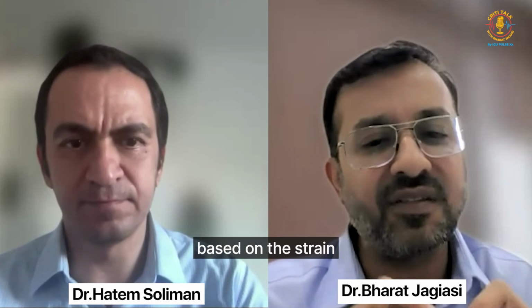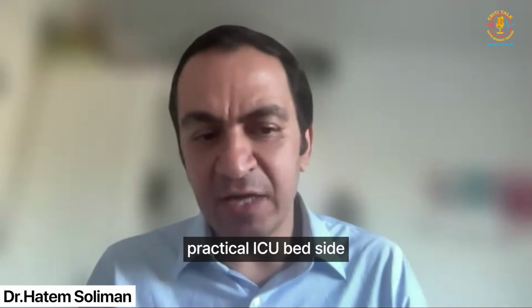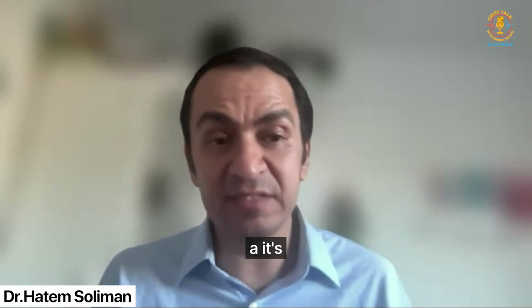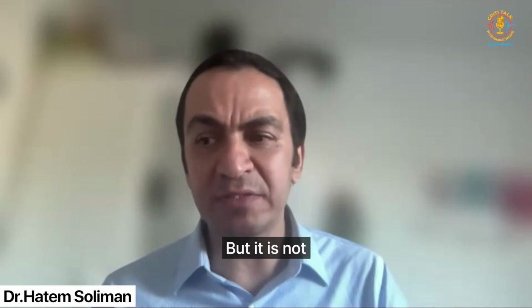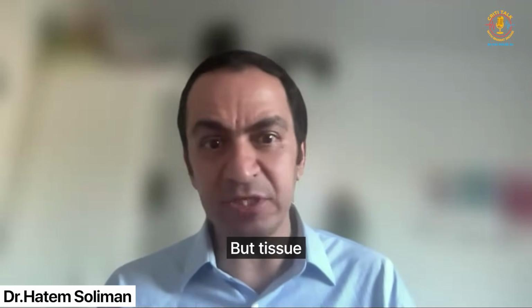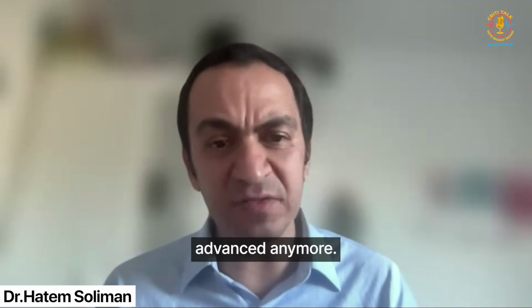Can we plan a vasoactive strategy based on strain or RV strain in sepsis? So strain, I don't think it's yet practical at the ICU bedside. It's still mainly research based, and it's somehow available. We do have strain capabilities in some of our point of care machines, but it is not yet an acute parameter. But tissue Doppler and RV assessment are all available and they are not advanced anymore.